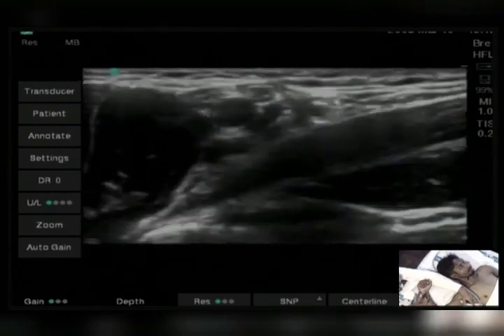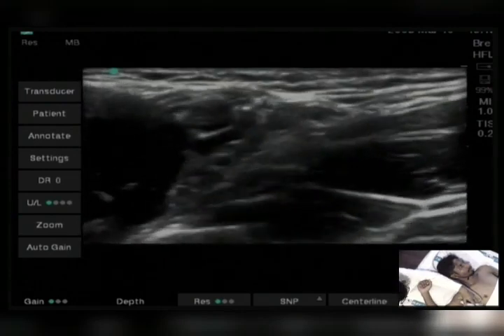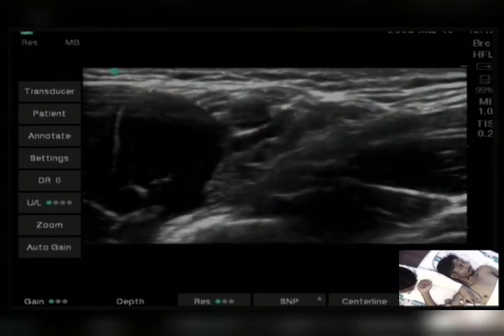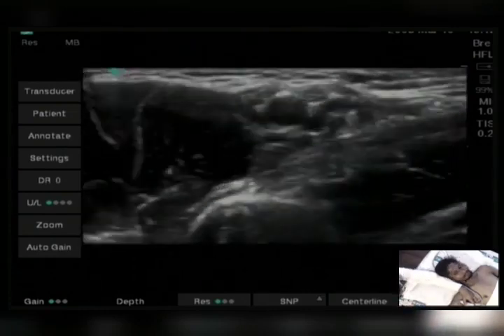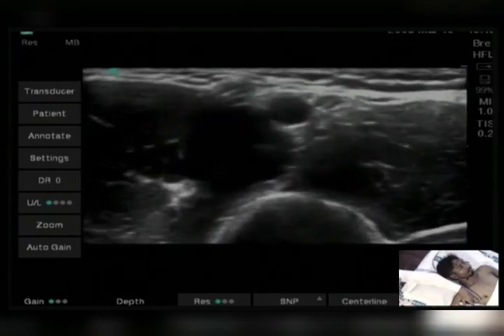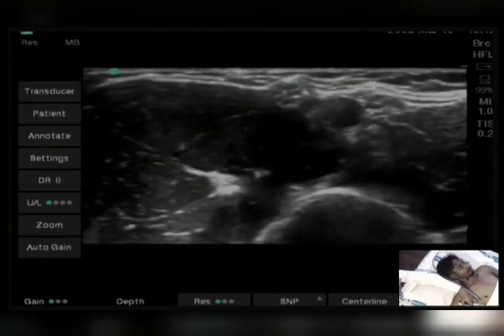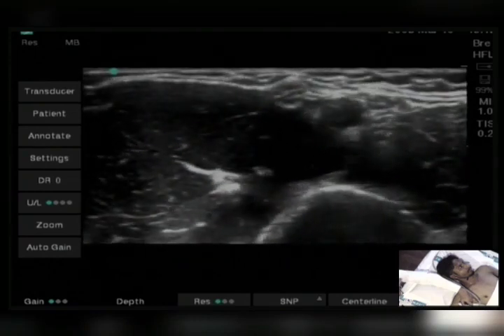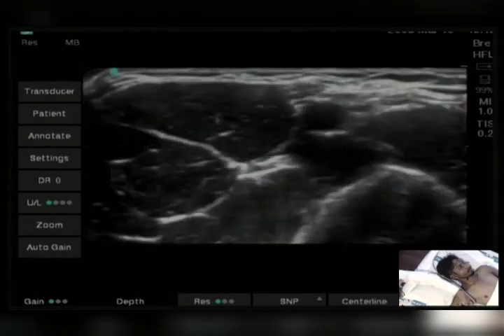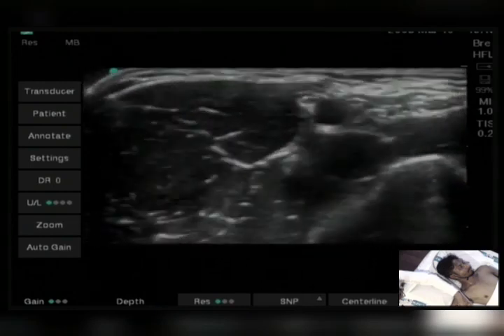Okay, we'll go for the median now, on the top of the axillary artery, and this artery is this. Now the median lies almost nearer to this axillary artery. See, I am tracing toward the elbow. The median nerve lies on top at 11 or 12 o'clock positions. When we go toward the elbow, this median nerve lies laterally, and it will flip toward the medial.